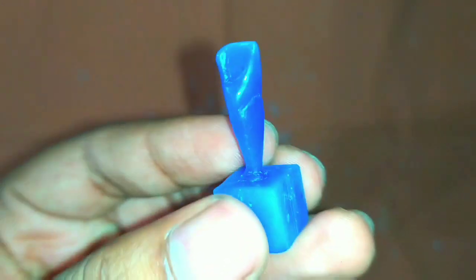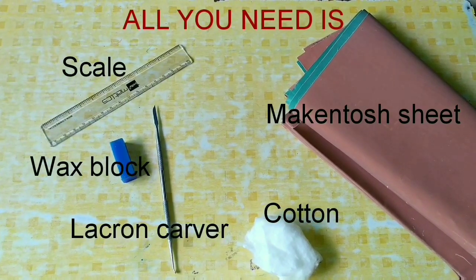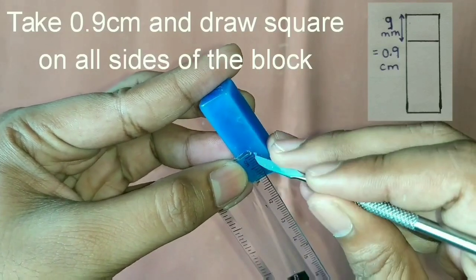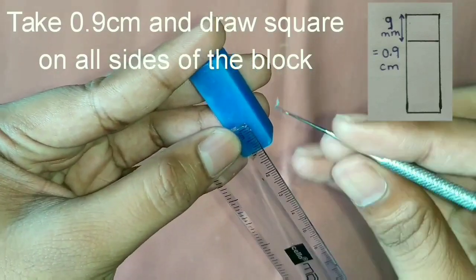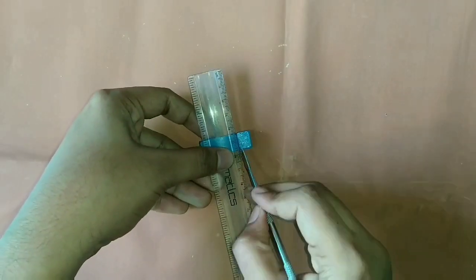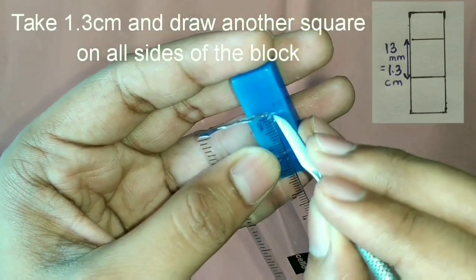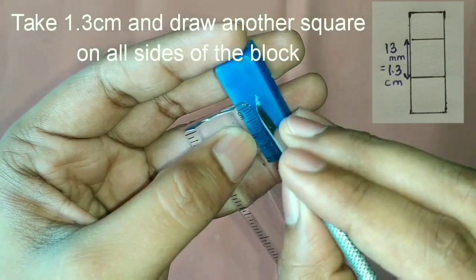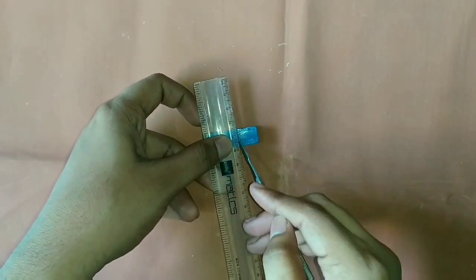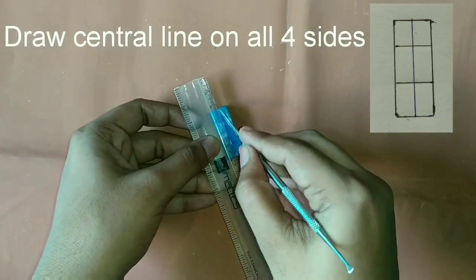These are the things we require. First of all, take 0.9 cm and draw a square on all the sides of the block. Then similarly take 1.3 cm and draw another square on all the sides of the block. Then draw a central line on all 4 sides.